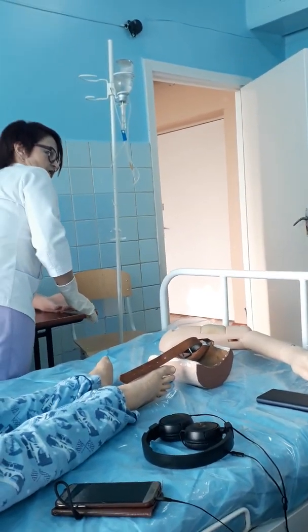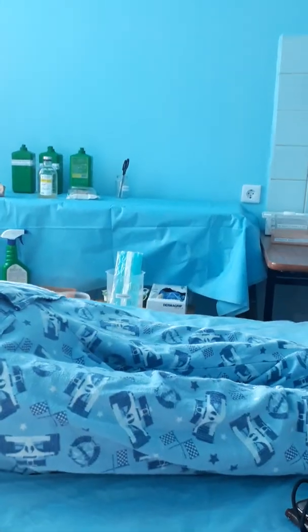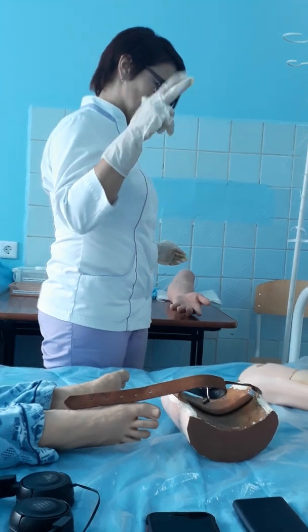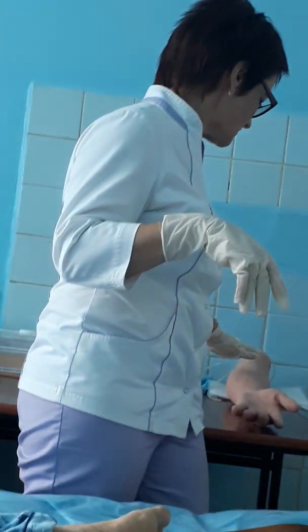Palpate the hand and put it in the hand. In this part more often you will use a special needle like butterflies. After two classes I will show you this type of needle.